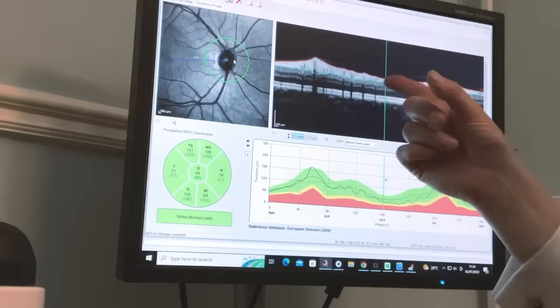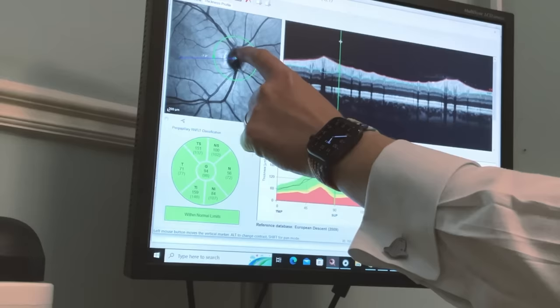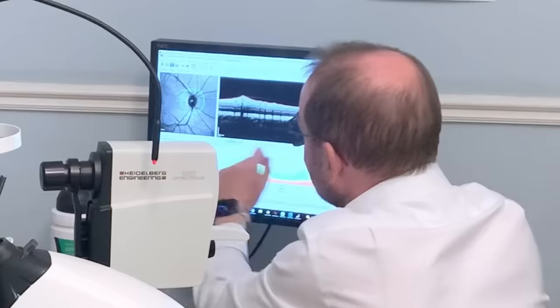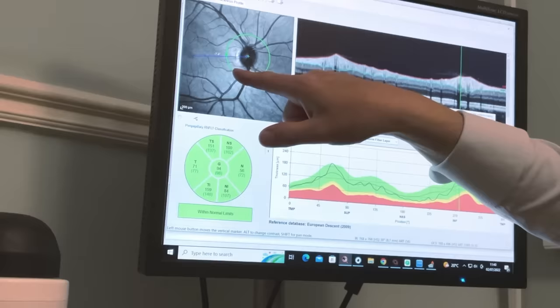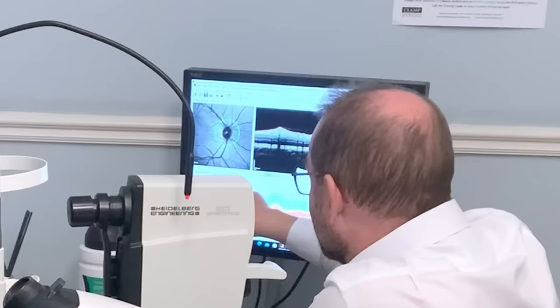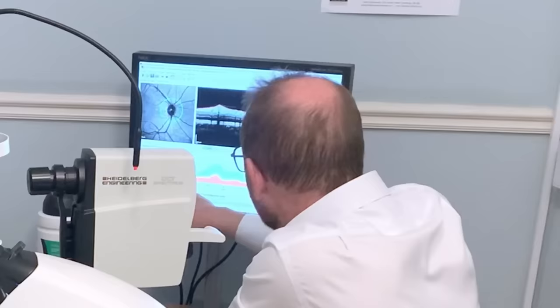This machine measures the thickness of the nerve fibre layer all the way around the rim. If we slide this over here, this is a cross section through there of the thickness of the nerve fibre layer. As I drag this over, it's a different cross section all the way around. And this is it mapped out, showing the thickness. Over here, it shows the quadrants of the areas of the thickness, with your thicknesses and then averages as well. All of that looks really healthy and within normal limits. So that's good.